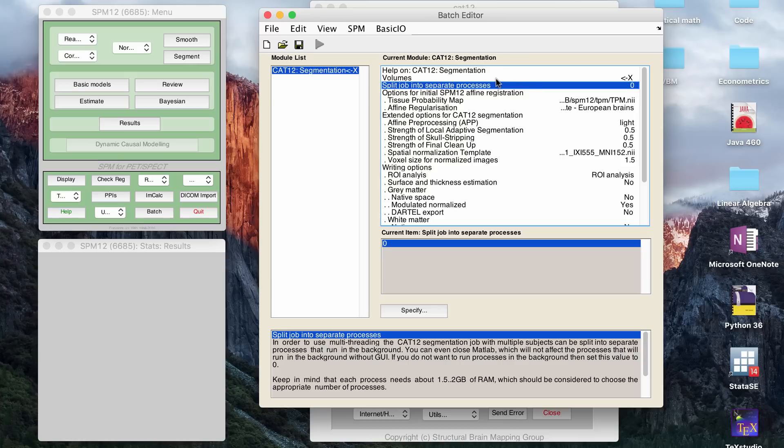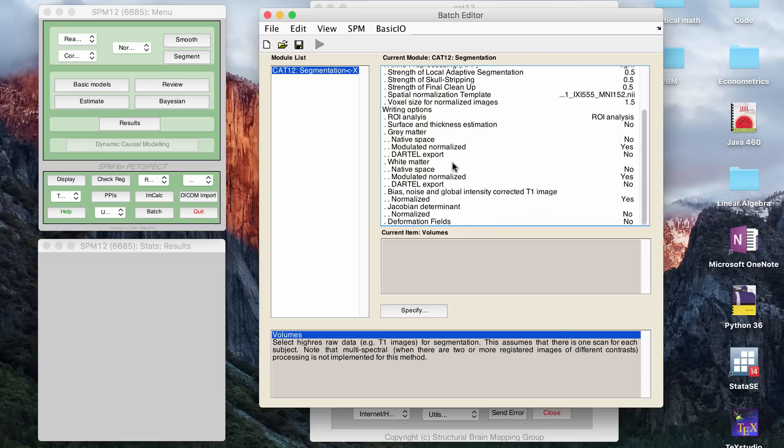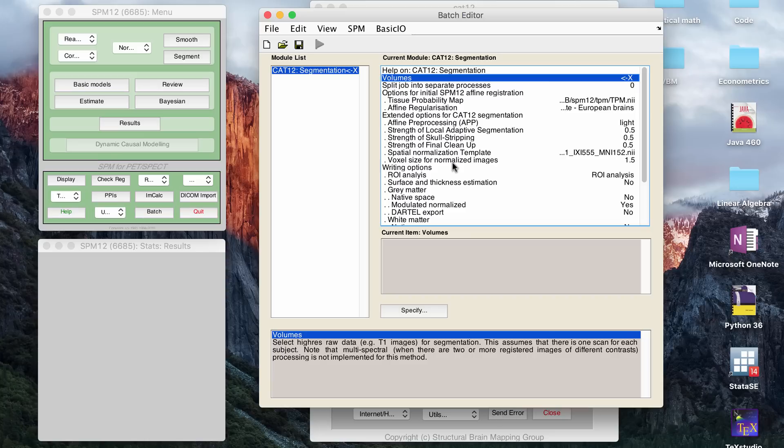So for some reason on my work computer, it doesn't work if I just use the default, which on my work computer, it was four. But if you change it to zero, then it will run each file individually instead of trying to split the job, and that will work.